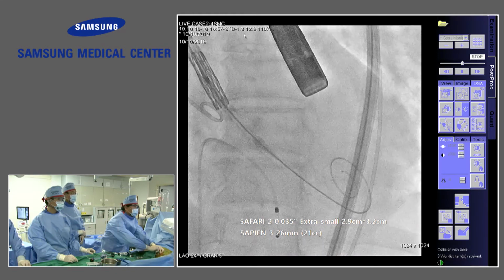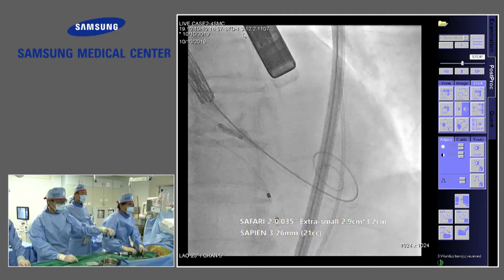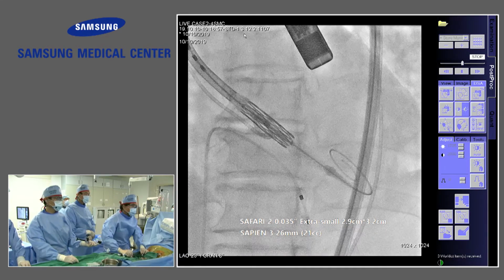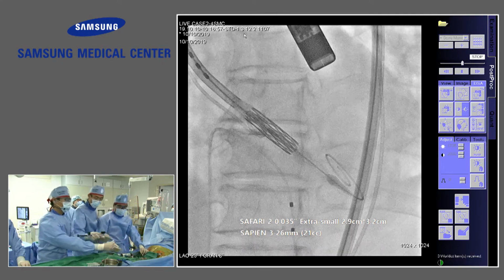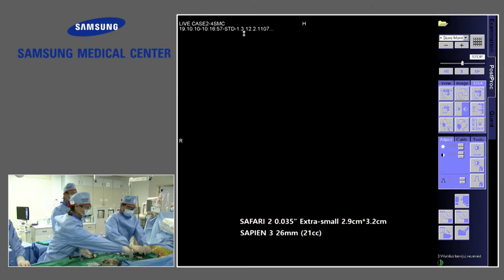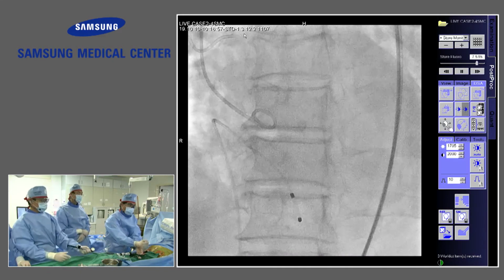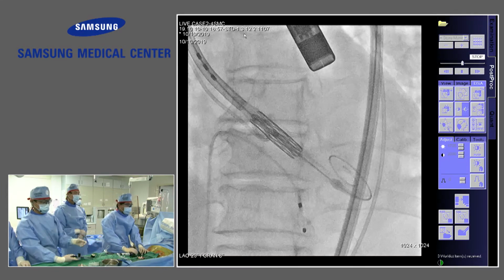Well, I sound like a broken record whenever I'm asked that, because people think, and I think justified, that it's easier to go through after TAVI with Edwards. But as we gain more and more experience, we know that going for PCI after a self-expandable valve like Evolut becomes easier and easier. And in this sense, the GuideLiner became my best friend in the cath lab.